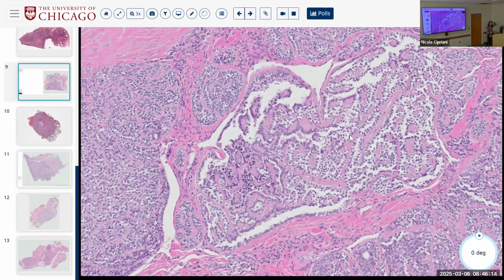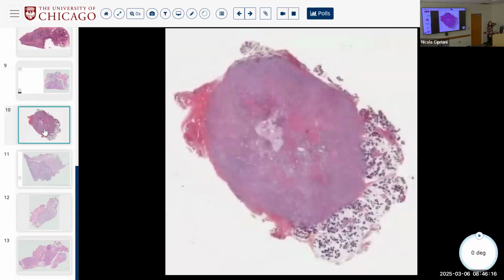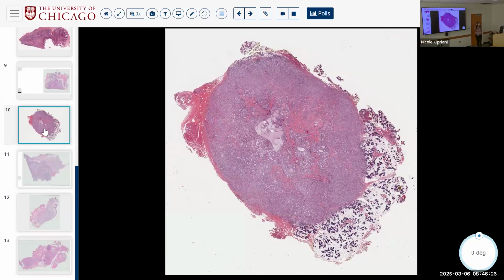What's the molecular profile of epimyoep? HRAS. So just like thyroid follicular neoplasms, it also has RAS. So keep epimyoep on your differential of biphasics with clear cytomorphology.